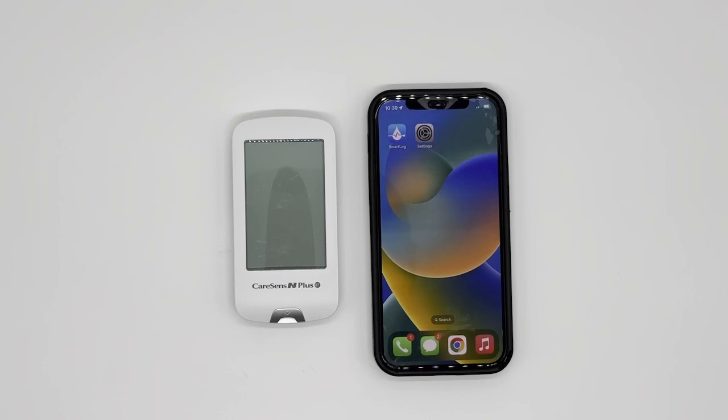Hello everyone, my name is Sun from MySense USA. In this video, I would like to show you how to pair the CareSense N Plus BT blood glucose monitor, as well as troubleshoot, to your phone via the SmartLog mobile application. It is important to download the SmartLog mobile application, so please go to your app store and download and install SmartLog.